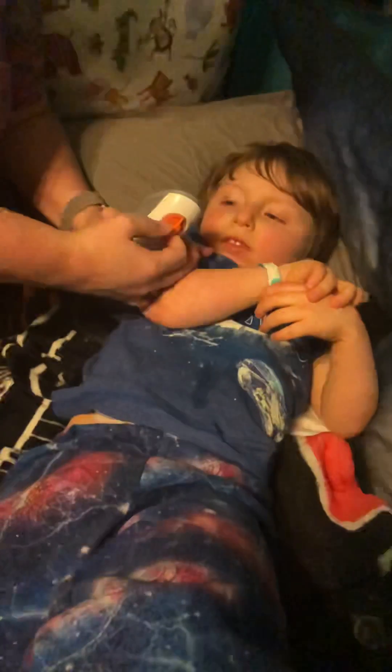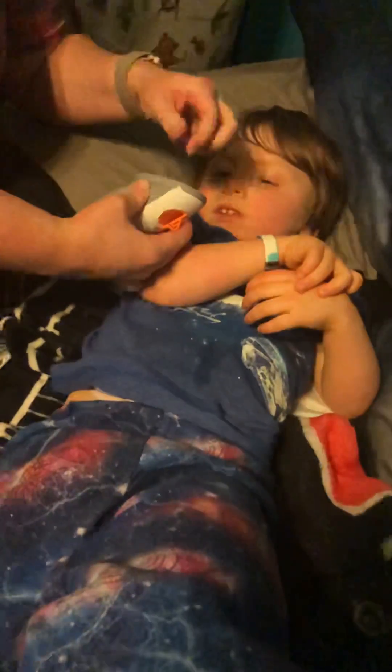We've got him alcoholed off and we've already put our coating in. So we're going to peel off the tabs and stick this on the back of his arm. Dad, if you want to get over on this other side so you can kind of see what's happening.